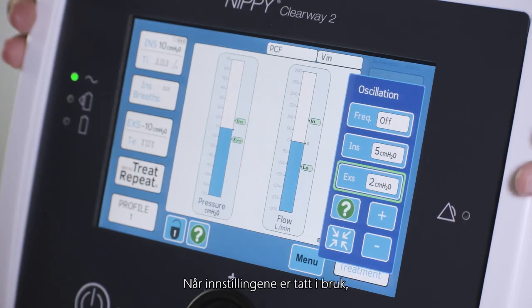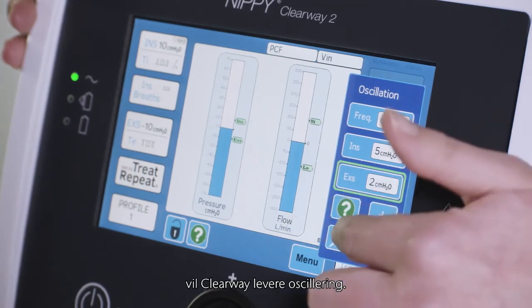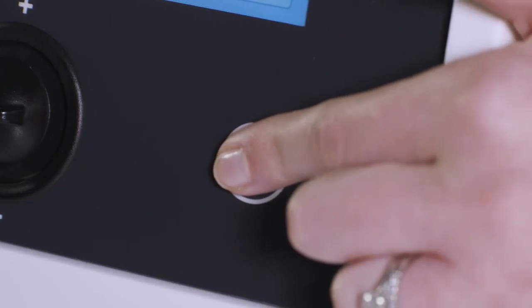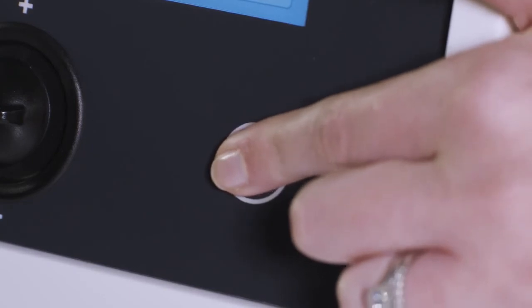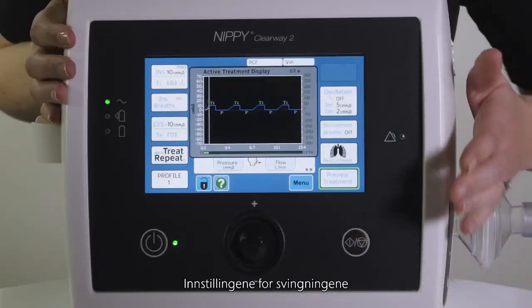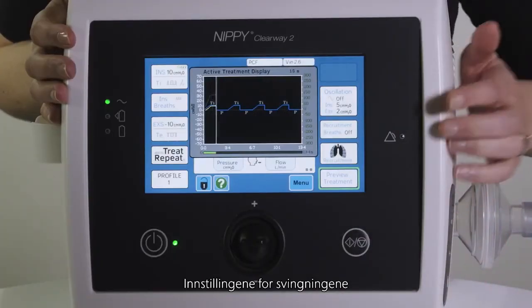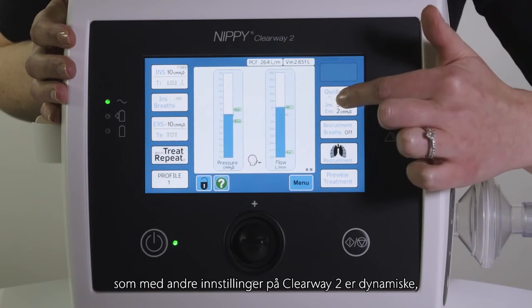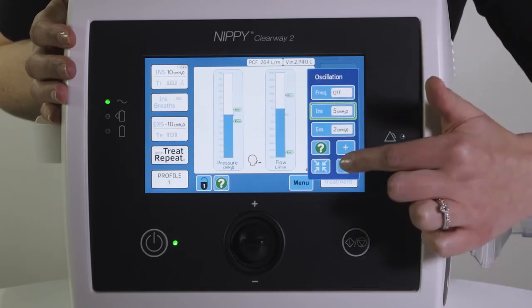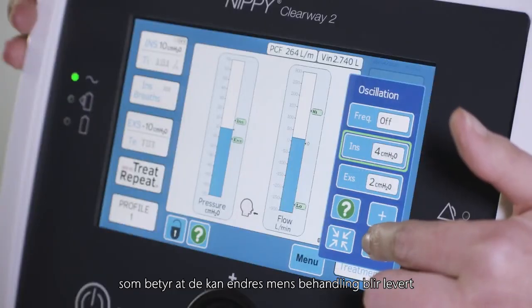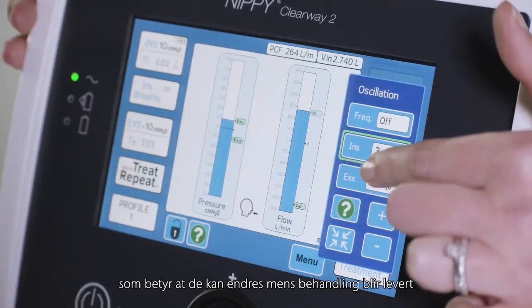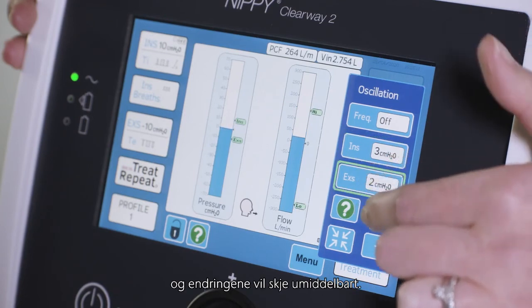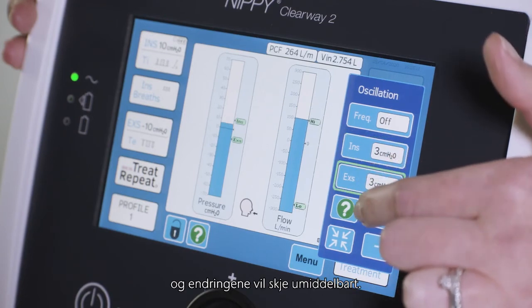Once the settings are applied, the Clearway will deliver the oscillations. The settings for the oscillations, as with other settings on the Clearway 2, are dynamic, meaning that they can be changed while treatment is being delivered and the changes will be applied immediately.